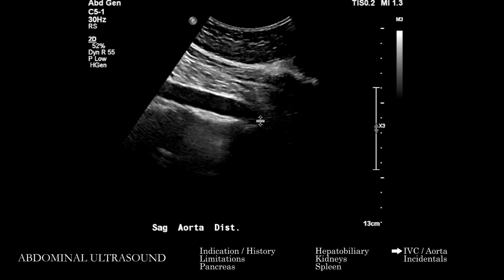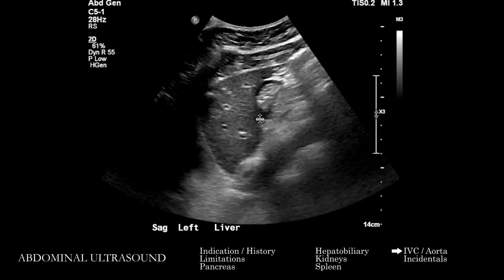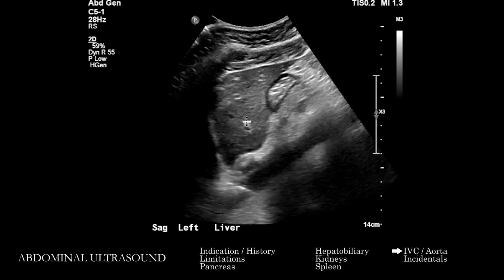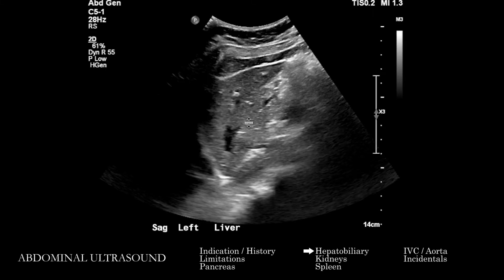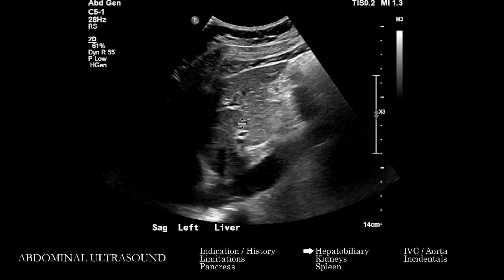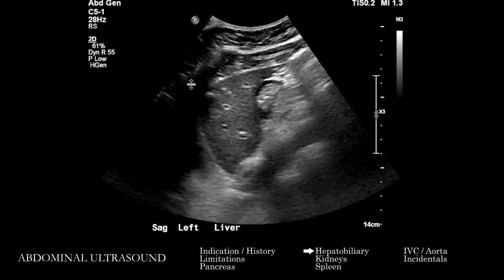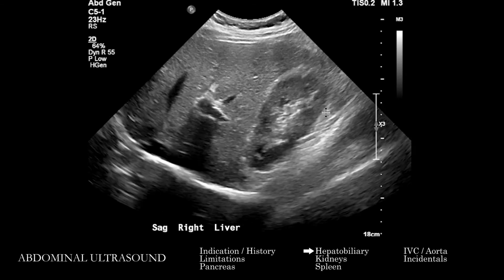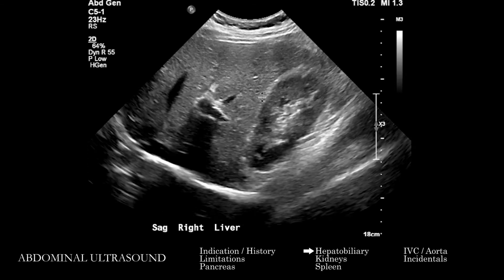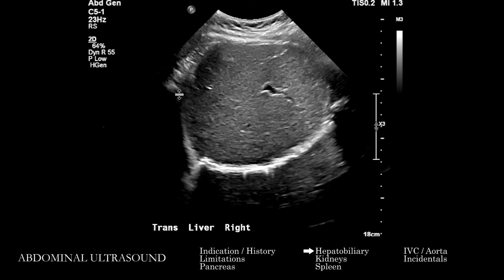The major things to think about with the aorta are: is there an aneurysm, and are things patent generally? When we get to the images of the liver, it will be imaged in various windows. On each image, you want to get a sense of the overall echogenicity of the liver parenchyma and compare it to the renal parenchyma when both are seen. You want to see if the parenchyma is homogeneous or heterogeneous, and look for mass lesions, cysts, fluid collections, and any mass effect on the liver vasculature.